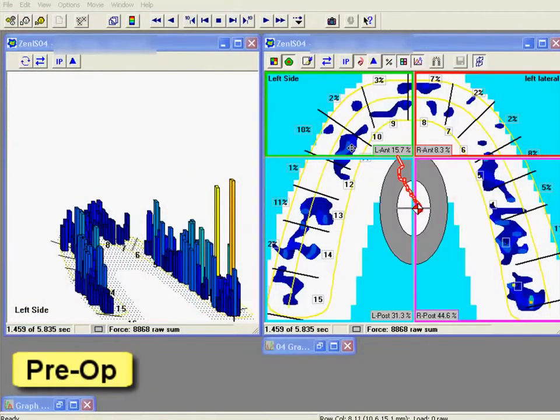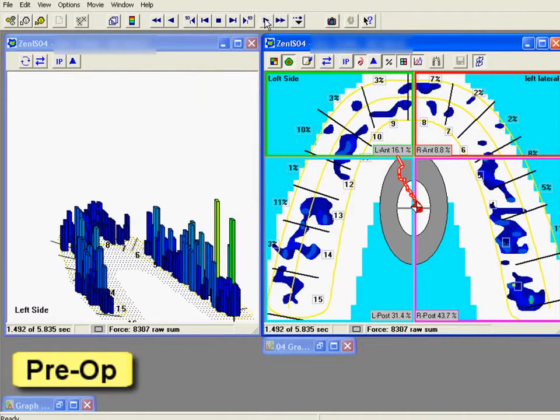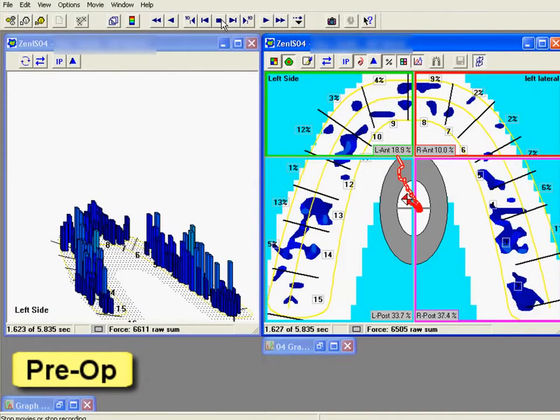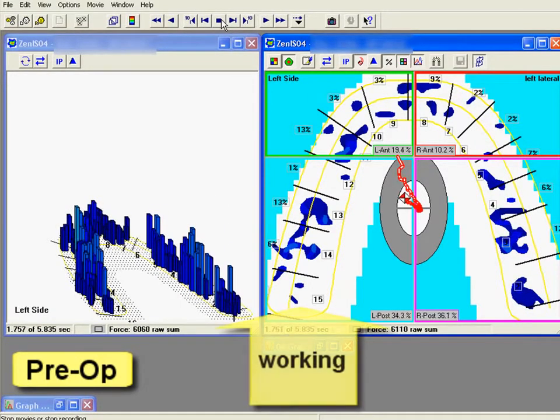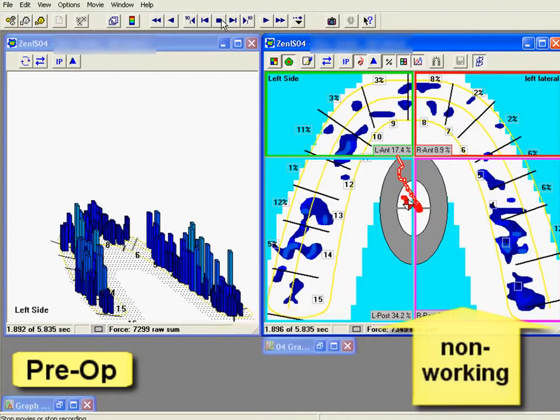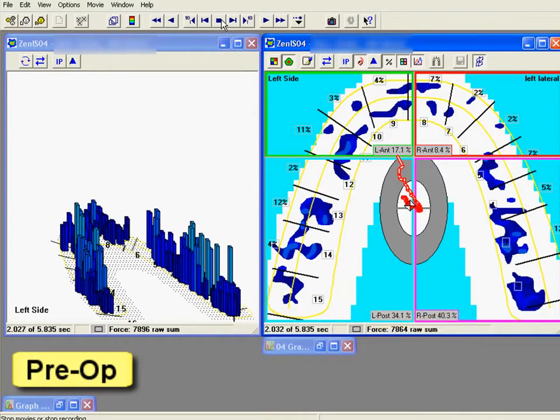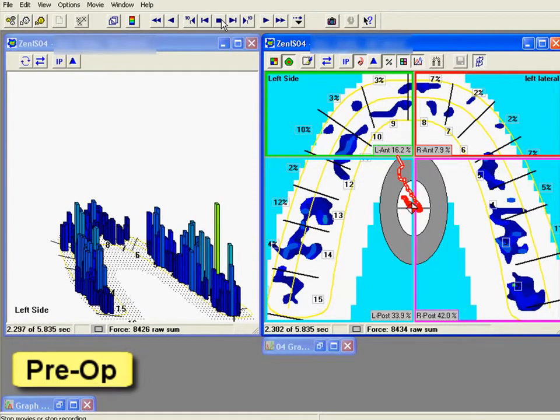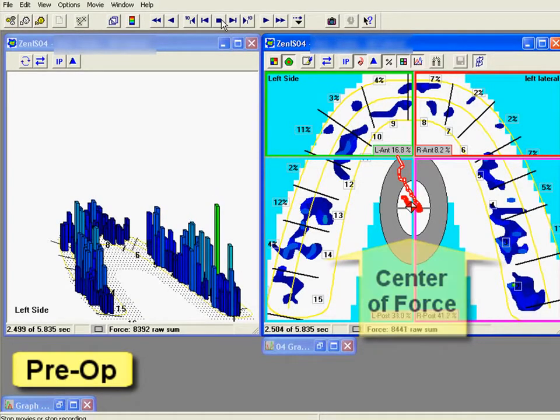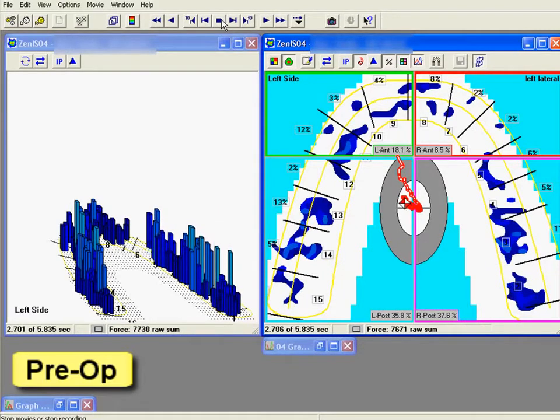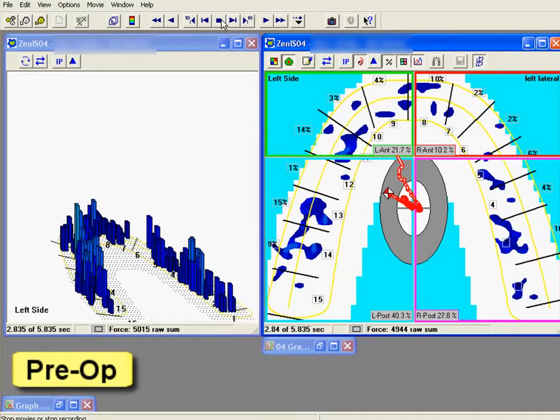The pre-op treatment T-scan data shows that the excursion begins. As the patient begins their excursive movement left, we see that both the working side left and the non-working side right are in contact. As the patient continues their excursion, the group function is persisting. See the center of force moving posterior left, while the posterior left and posterior right both maintain contact.